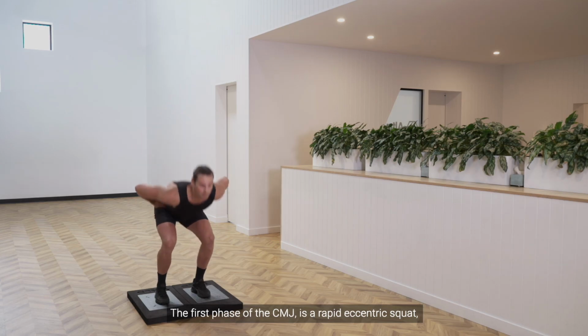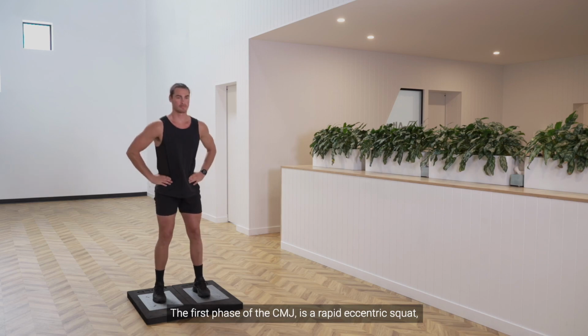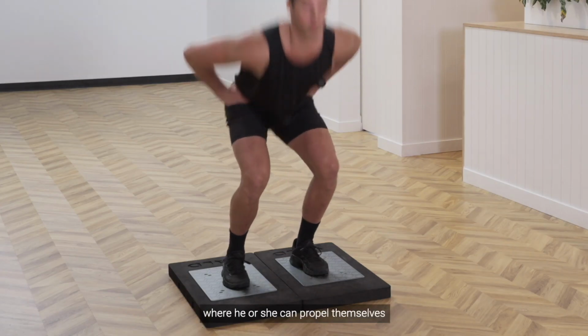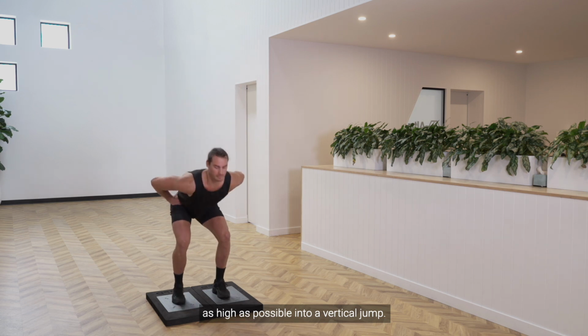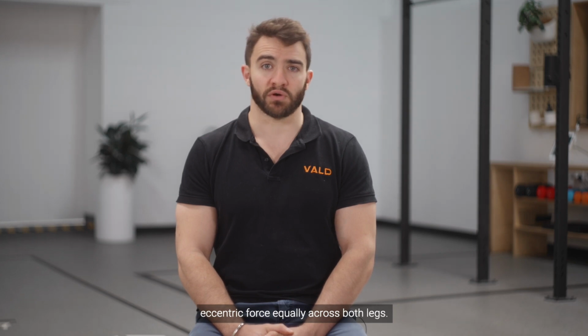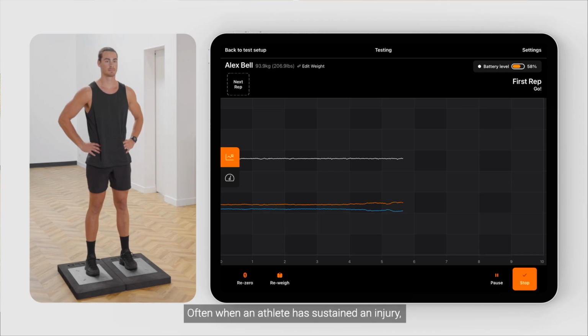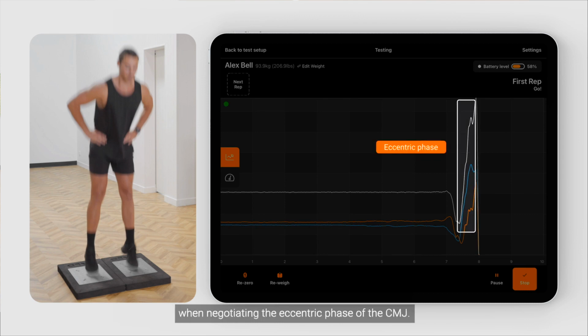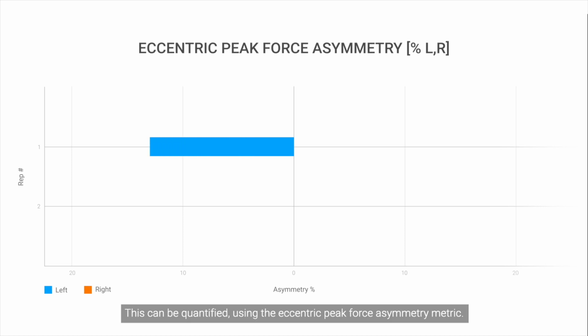The first phase of the CMJ is a rapid eccentric squat, during which the athlete quickly bends down into a position where he or she can propel themselves as high as possible into a vertical jump. It is important to see that the athlete can generate eccentric force equally across both legs. Often when an athlete has sustained an injury, they may favor one side over another when negotiating the eccentric phase of the CMJ. This can be quantified using the eccentric peak force asymmetry metric.